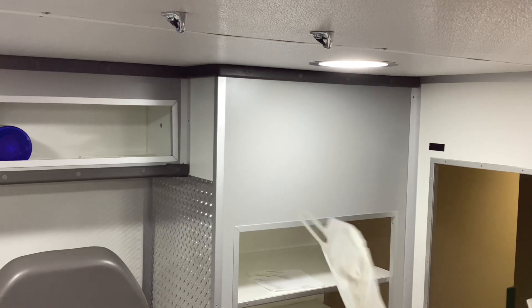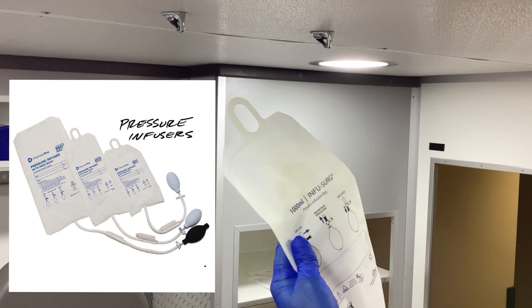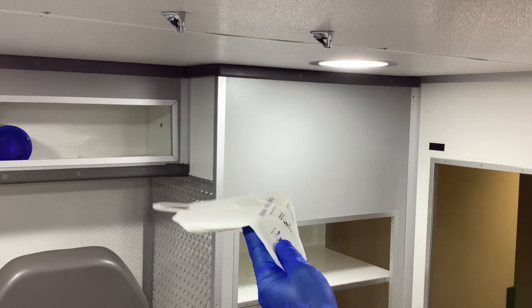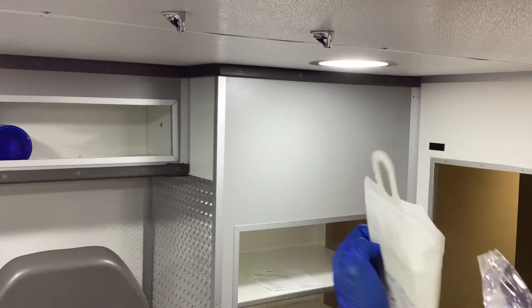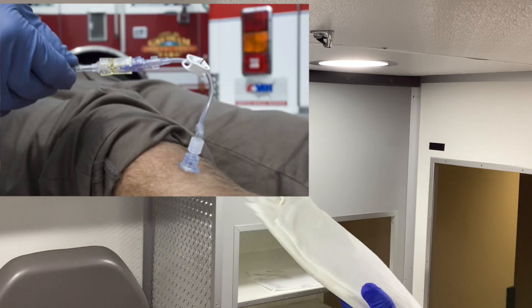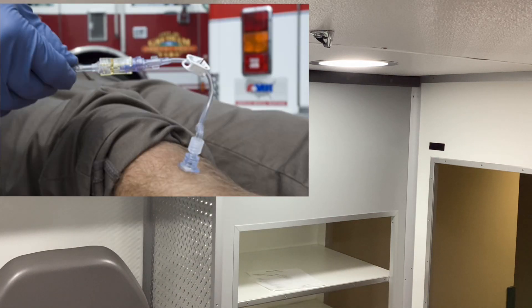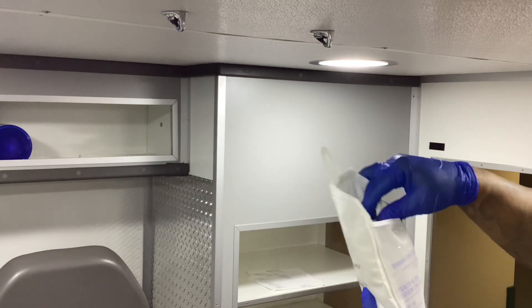All right, Titans, we've decided that we need to utilize a pressure infuser bag for our patients, whether it be in the IO or what have you. So we have a 1,000 ml Infosurge pressure infuser. First thing we want to do is after our bag is spiked and fluid is being delivered to our patient, we want to slide our bag into the pressure infuser.